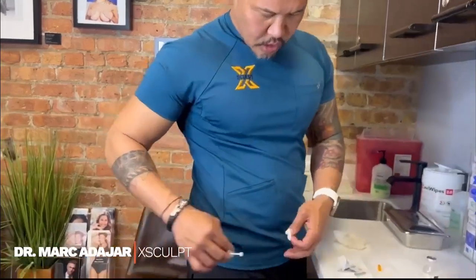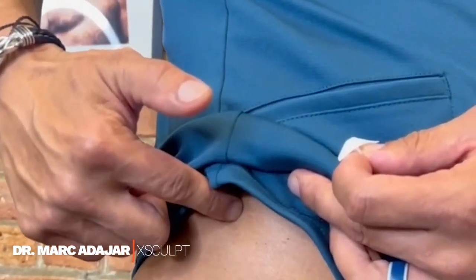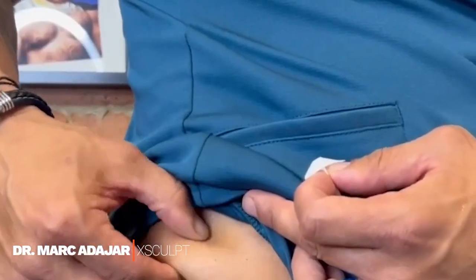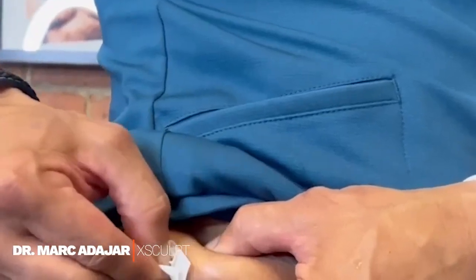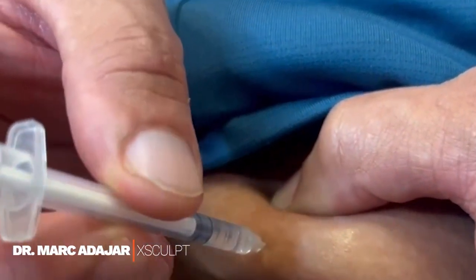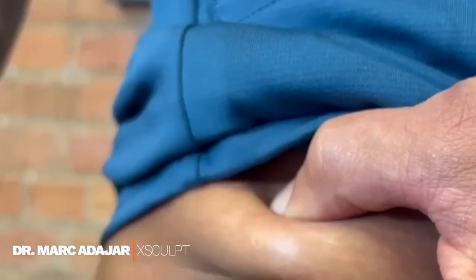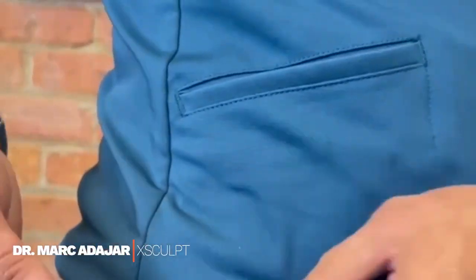What you want to do is inject into the fatty area of the love handle or flank area. Theoretically you can do it anywhere you can pinch, but you want to find an area where you can pinch your skin. Pinch your skin and clean the area with an alcohol pad. Then grab your insulin-like syringe, slowly insert it, then gently push in all the way nice and slow, and then pull it straight out. If there's a little bit of blood, just wipe it with the alcohol pad — and that's your injection.